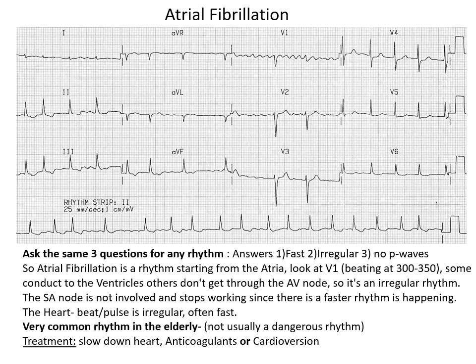Okay, so let's have a look at this next slide, atrial fibrillation. So this is an ECG, an electrocardiogram. So you'll notice that if you count, there's 12 leads starting at the top left, lead 1, going all the way to the bottom right, not including the rhythm strip at the bottom, to V6.